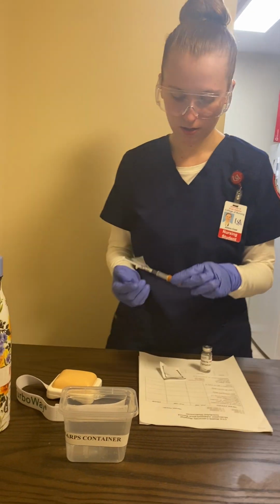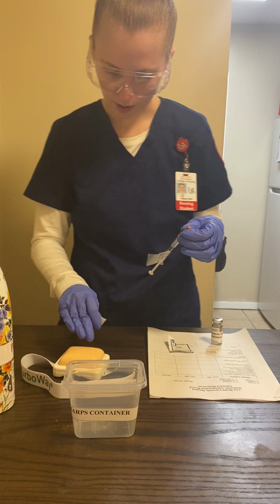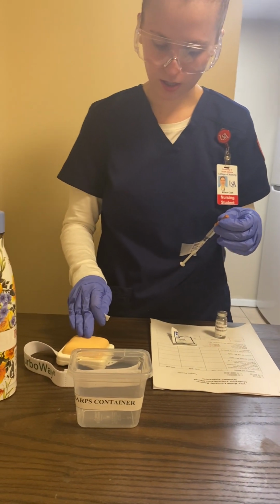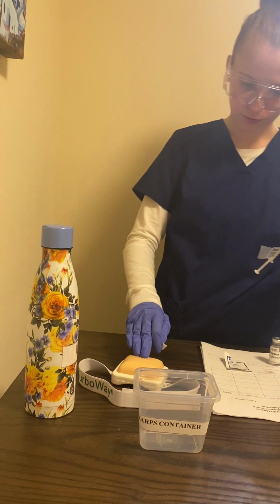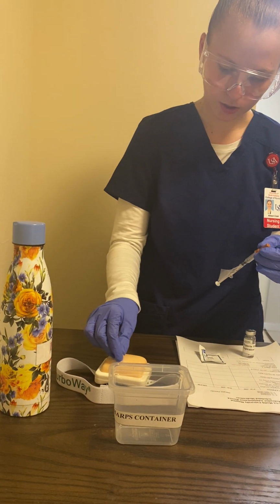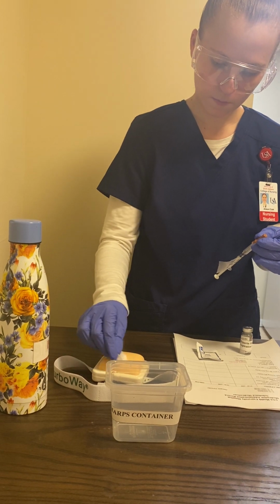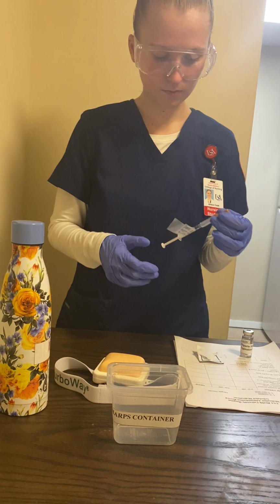And so what we're going to do is first I'm going to assess the skin and make sure there's no bruising. And I don't see any bruising. I'm gonna go ahead and clean in a circular motion. Okay, go ahead and throw that away.